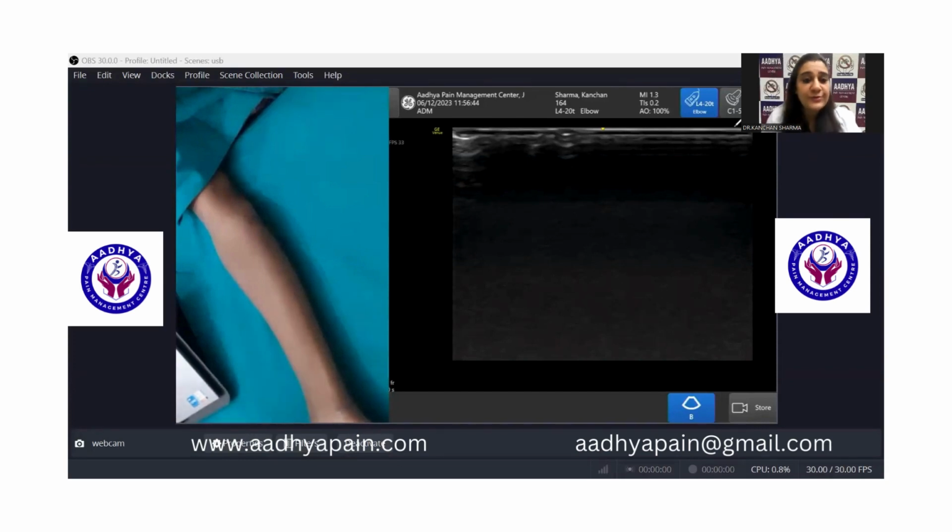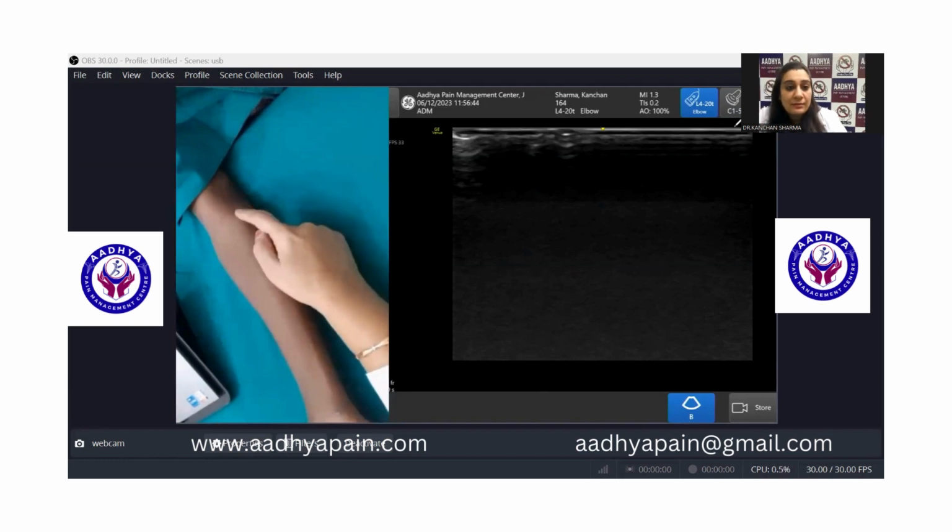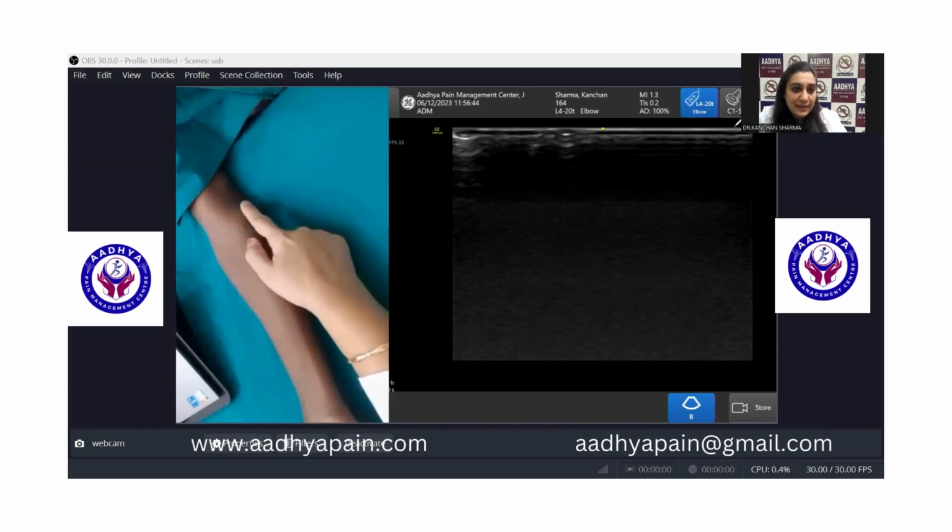Now, if you want to scan the common flexor tendon, the patient is sitting across the table, shoulder in forward flexion, elbow extended, forearm supinated, and palm facing up. Here you can palpate the medial epicondyle. This is the medial epicondyle, which is a bumpy thing present on the medial side.